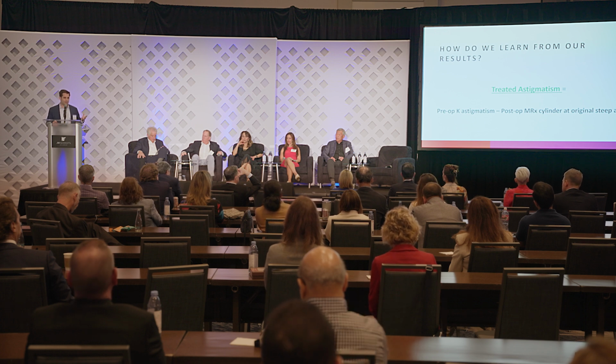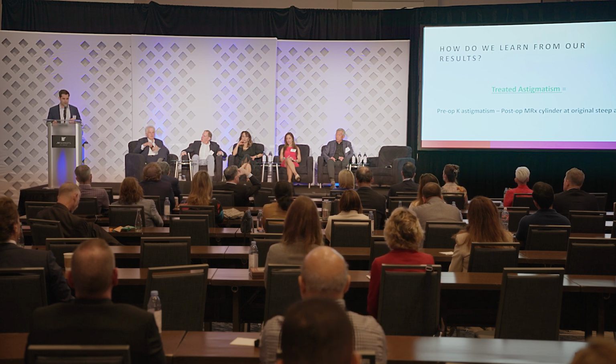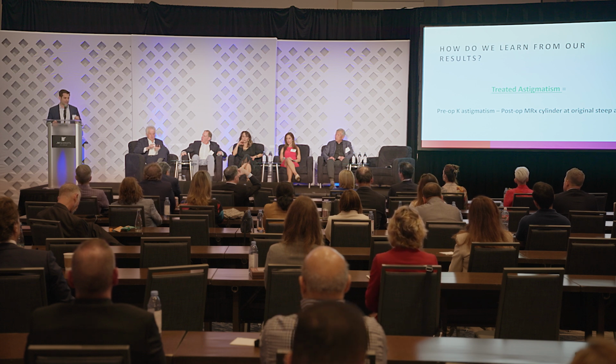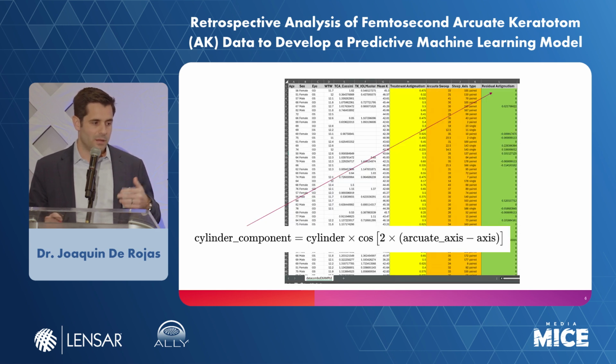So if you started with 0.5 diopters of astigmatism at 90, and you end up with 0.25 at 90, well, you've treated 0.25 of astigmatism. That's an important factor, because that's how our model is going to get better based on our outcomes. That's essentially why I was able to do a retrospective study but still create a better model. The only trick is that if you have two different axes, you have to subtract apples to apples. So you just have to do some trigonometry to convert the axis to the original axis.